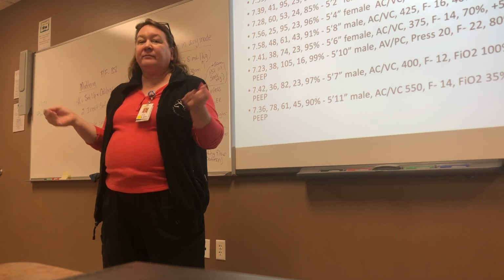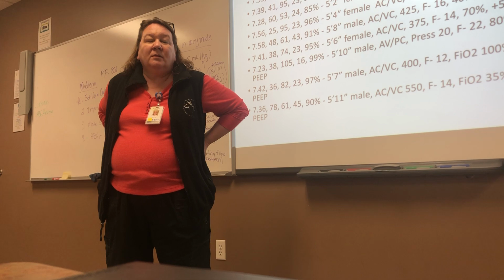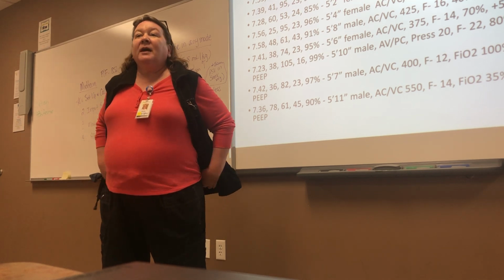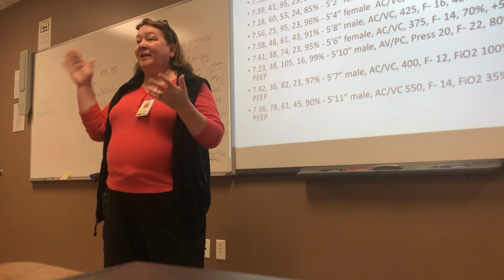For our calibration, does that include testing the alarms, like on the G5? On the G5, you follow whatever the card says. Okay, but other ones we don't have to test the alarm? No, it's built in. And then the other thing, some of the ventilators have built-in alarm settings, so you won't even have a setting for it.